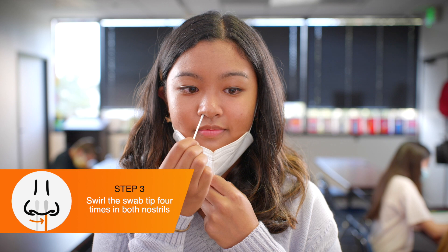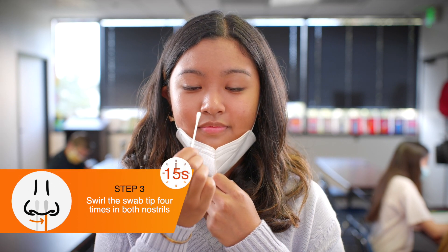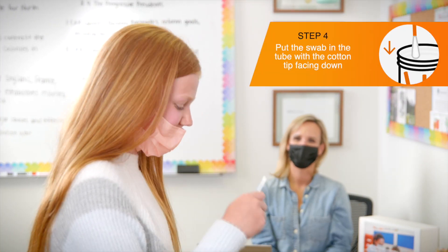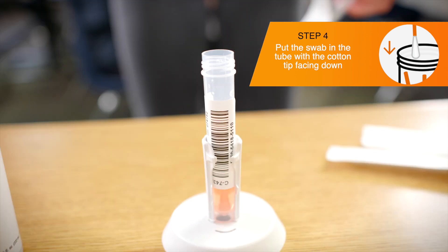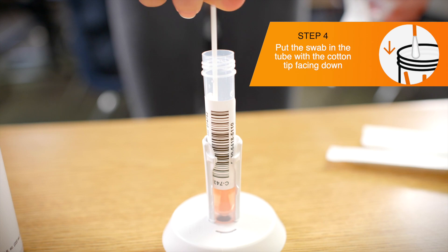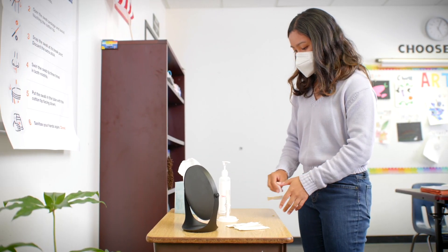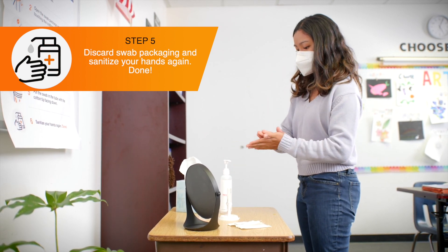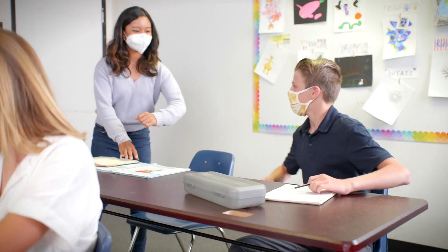Participants swirl the tip around the inside of each nostril at least four times for about 15 seconds. Once participants have collected their samples, they can put the swab in the open tube in the tube holder, cotton tip facing down. There may be other swabs in the tube, so be careful not to tip the tube over. Discard the packaging in the waste bin. Sanitize hands again. Pull up mask to cover the nose and mouth. Participants can then return to their desk.